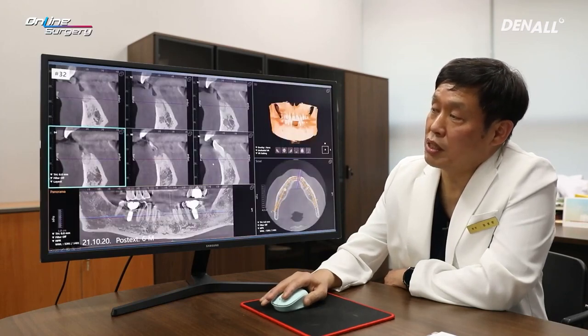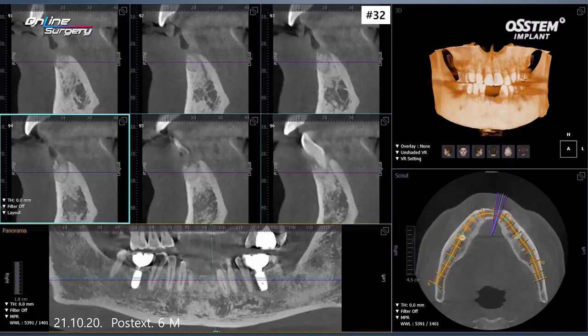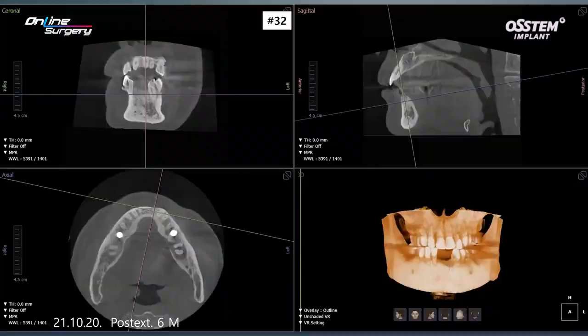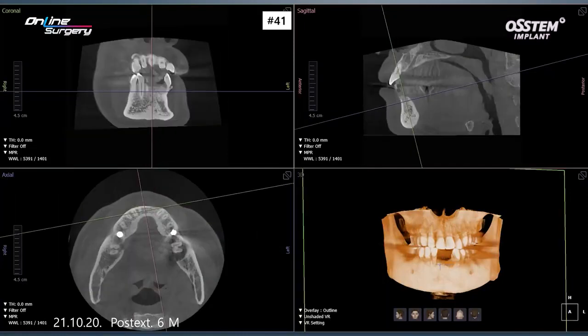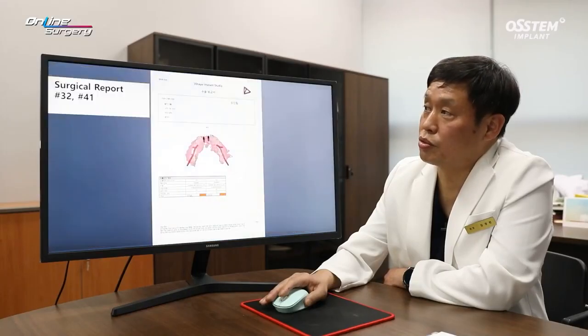In number 33 and number 32, socket preservation was done. You can see that after 5 months it is well maintained. However, I'm unsure as to how much bone has matured. This is number 41 — you can see healing in number 41, and on CT, numbers 32 and 41 are visible. Number 41 looks okay, however I am a little concerned about number 32.